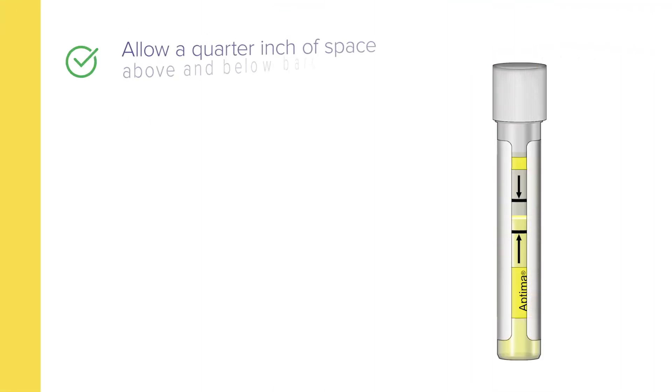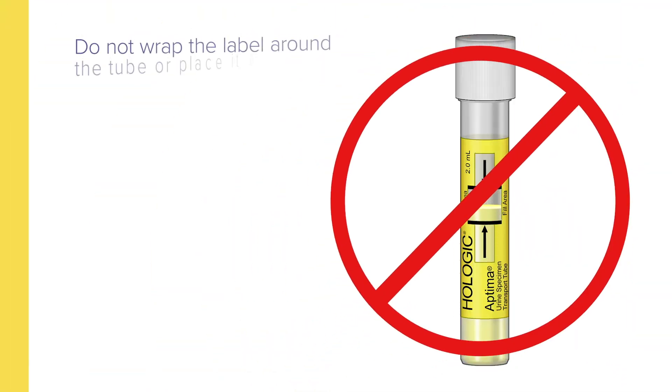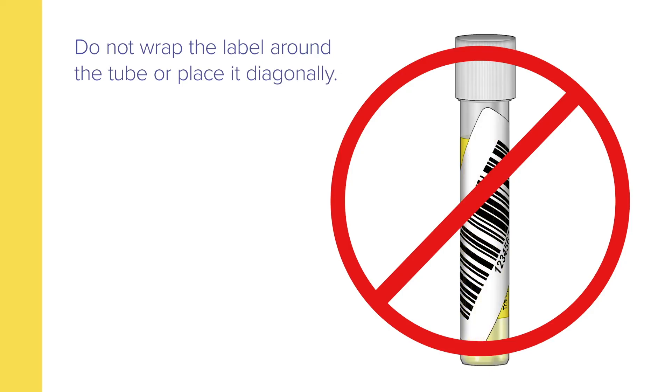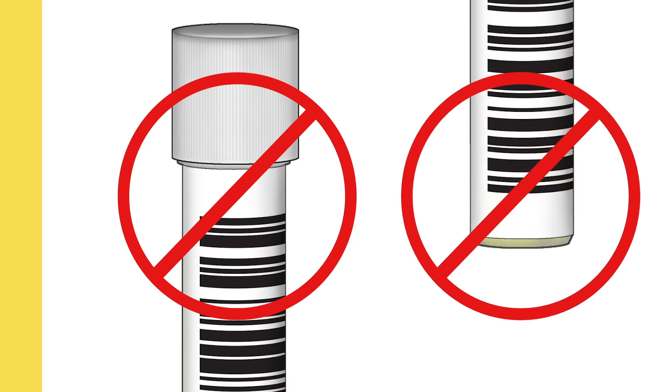A barcode label should be placed on the tube so that a quarter inch of space appears above and below it. Do not wrap the label around the tube or place it diagonally, or adhere it too closely to the top or to the bottom of the tube.